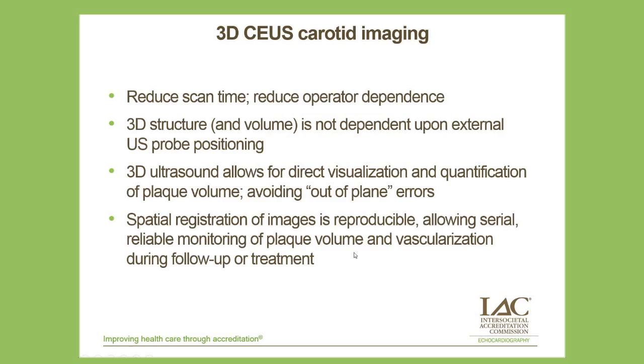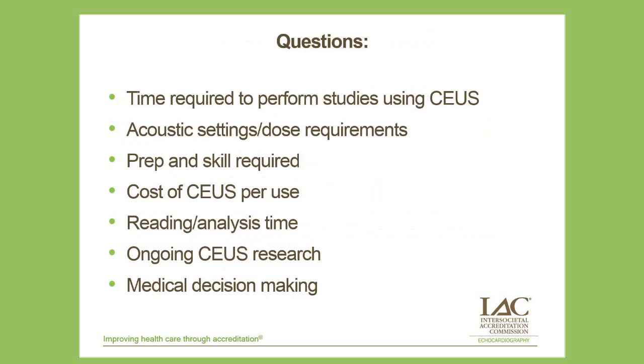and intraplaque neovascularization. So what can we then say about 3D contrast-enhanced imaging for the future? It'll reduce time, reduce operator dependence. We'll get 3D volumes, not 2D. We will not have out-of-plane errors. And the spatial registration is reproducible, allowing serial reproducible monitoring of disease, monitoring of patients.